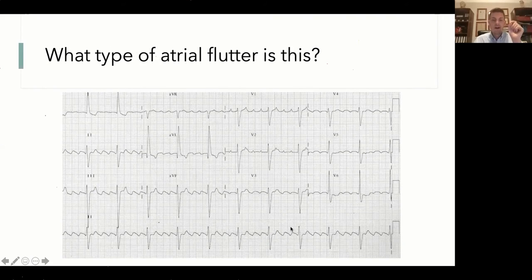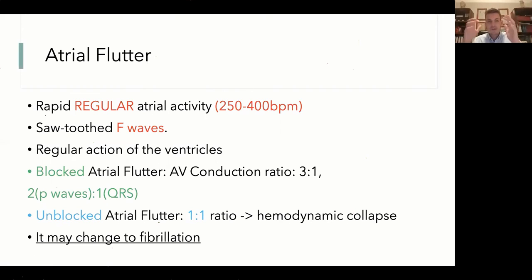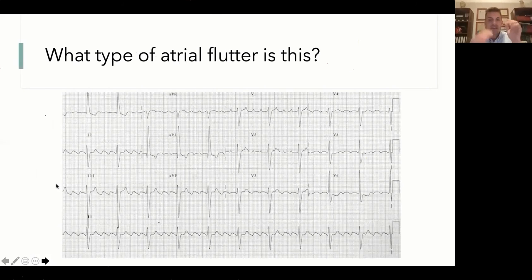If we have atrial flutter, it is very important to separate between blocked and unblocked. Does everyone understand why this is regular? Why this is irregularly irregular? Does everyone get this? Because the same pathology occurs constantly, but it's not normal. Okay, the other one is all over the place. Atrial fibrillation is all over the place. Atrial flutter is usually fixed. Does everyone understand the difference?